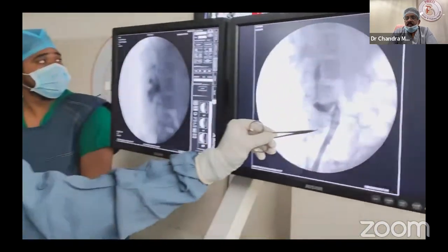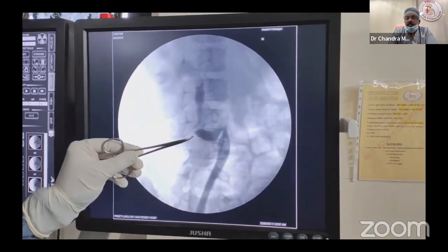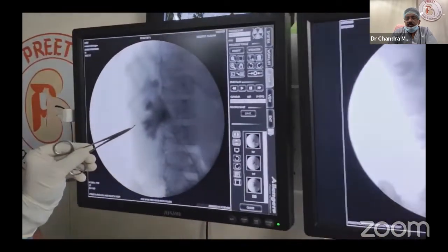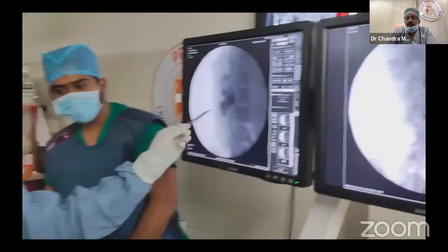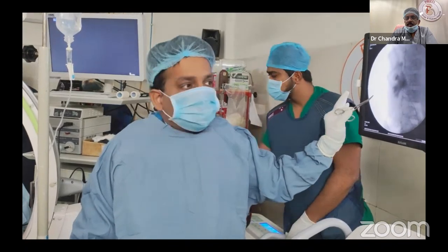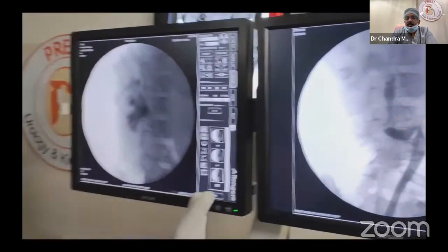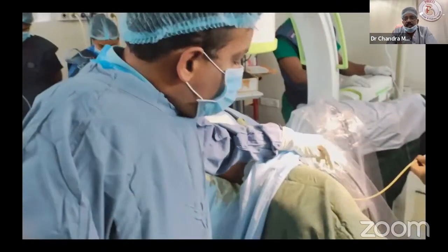Here, it is supine position. So there is a kink. There are two kinks. So going like this, reaching this, especially in this hydronephrotic kidney, unnecessary RIRS for a 5 year old baby. So opt for PCNL. No guidelines can guide this, but your common sense says that you can put a stent and do it. Why do anesthesia for the patient? Do proper supine PCNL.